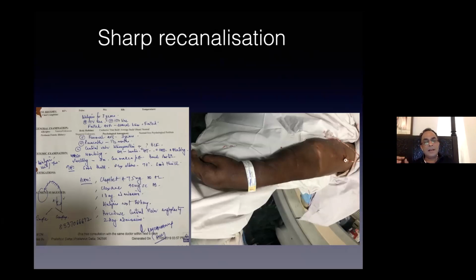Because we really torture the veins, you know, the way we cross and balloon. I see Virendra smiling, and we do a real torture. So I think leaving them slightly in an anticoagulated state prevents significant amounts of thrombus. Number one. Number two is vein is a low flow state, unlike the artery. So although I realize that we increase the risk of intracranial hemorrhage, and I've had 1 death secondary to intracranial hemorrhage, generally speaking, I find it quite useful.